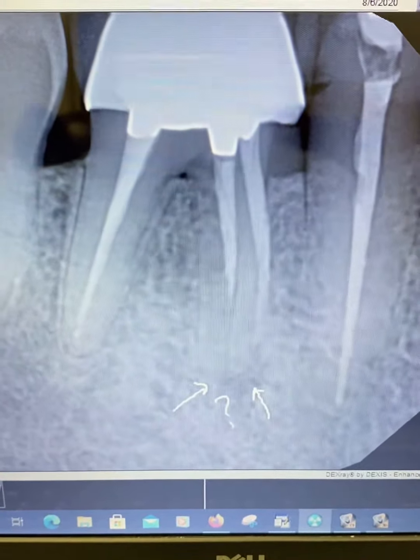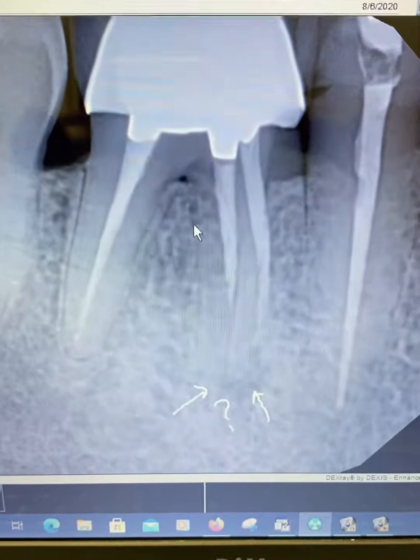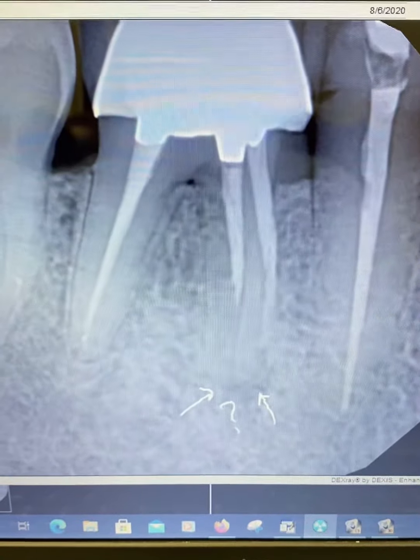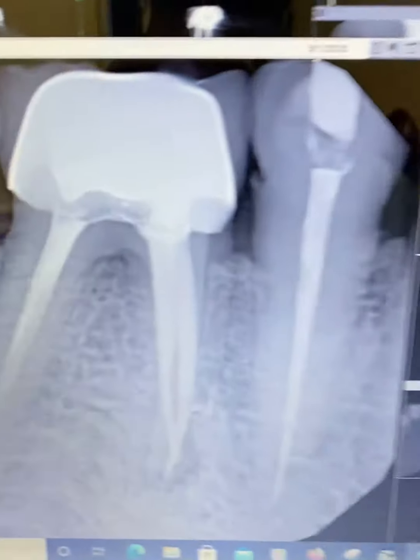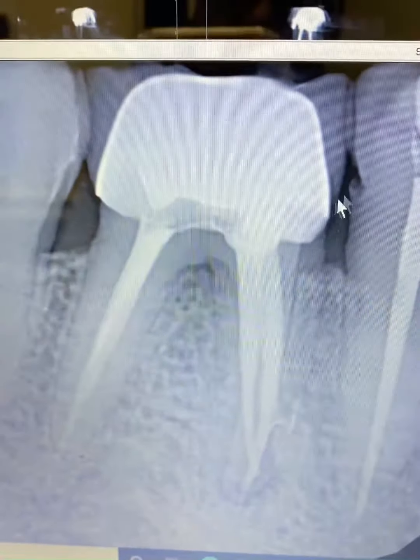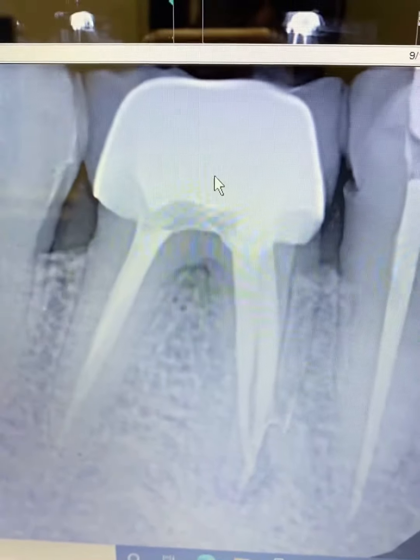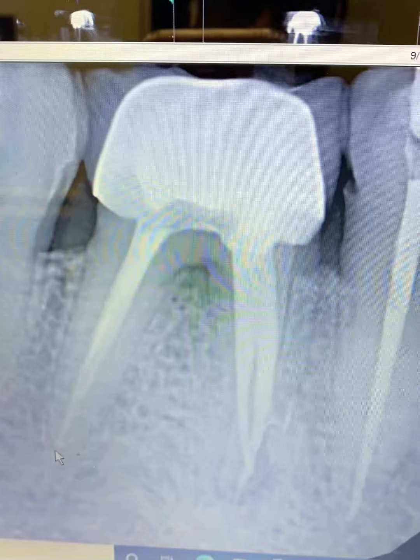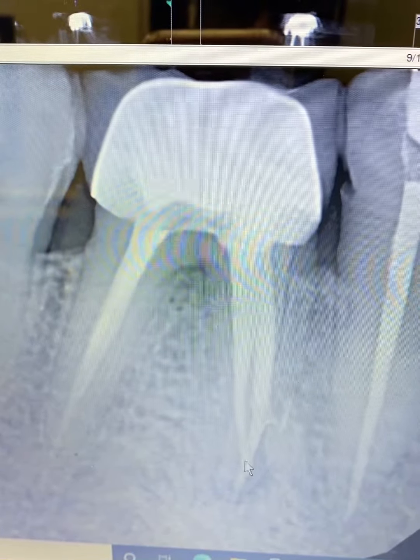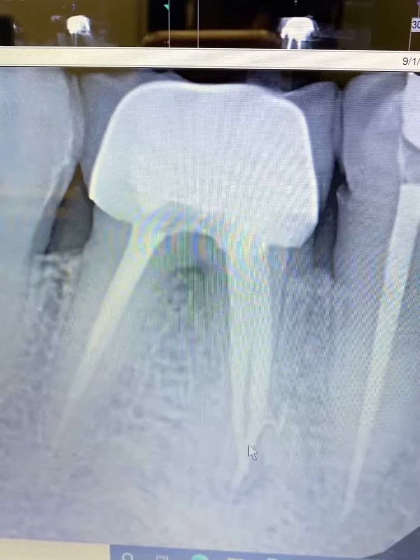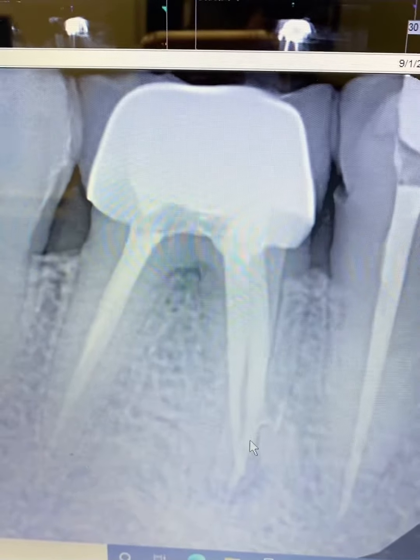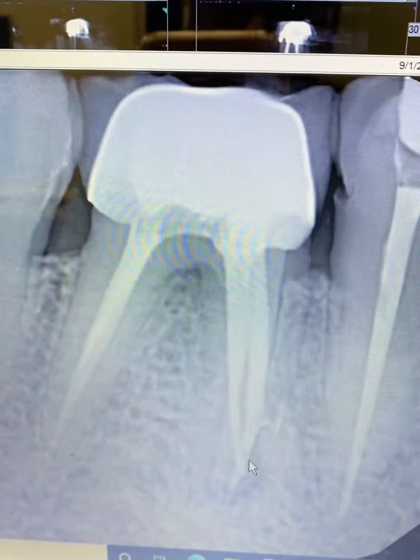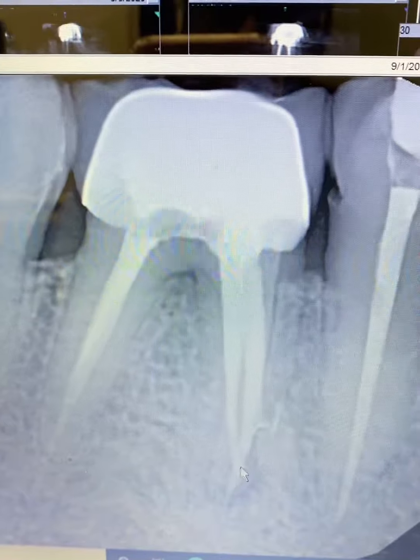This is what it was like before and this is after — got a nice result. We got everything cleaned out and sealed to the end of the root. We can see the mesial buccal and mesial lingual join at the apex.